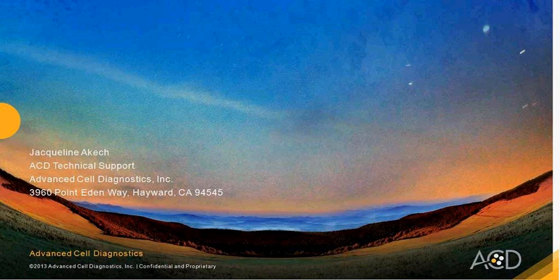The answer to that is, once you bake your slides, you can store the samples up to 1 week in a desiccant. This is actually an optional stopping point for you. Once you store them, you can proceed with the assay, but do not exceed 1 week for baked slides.